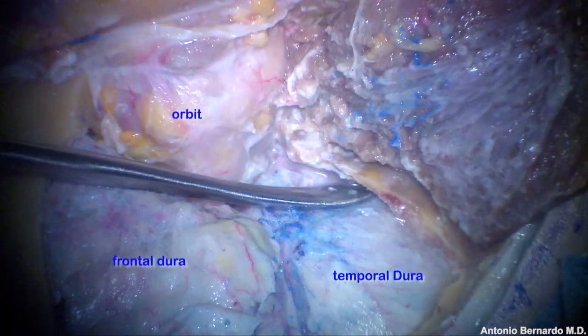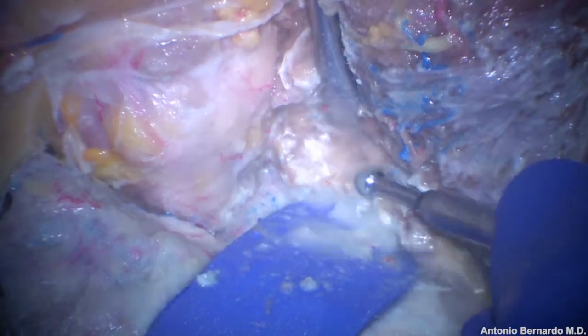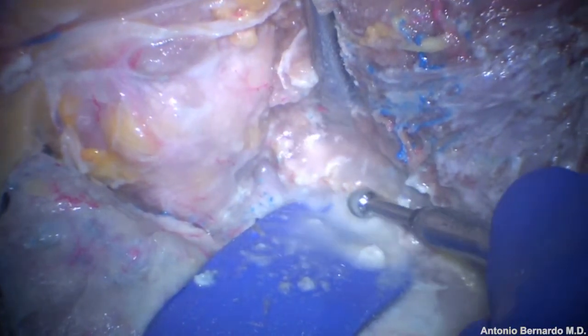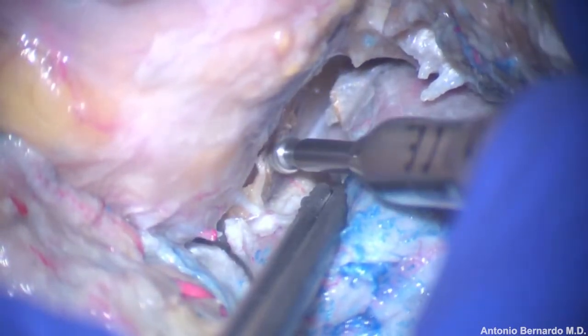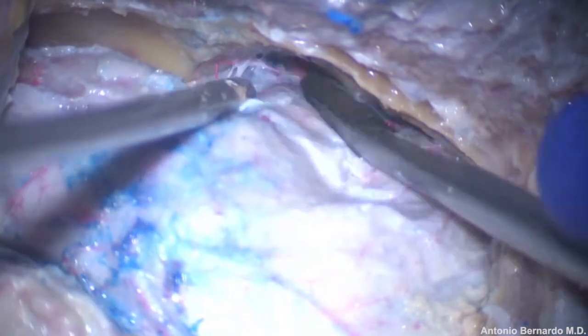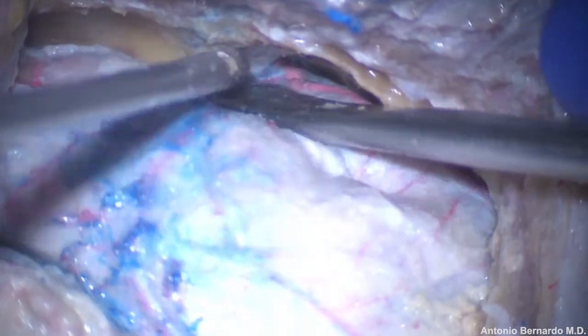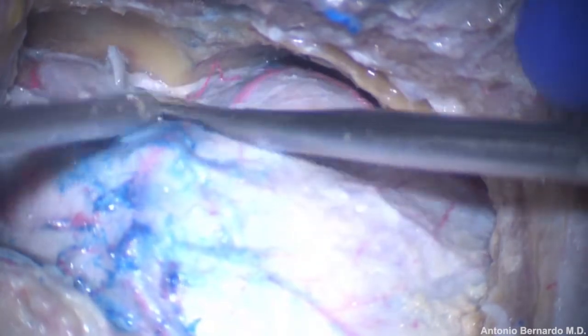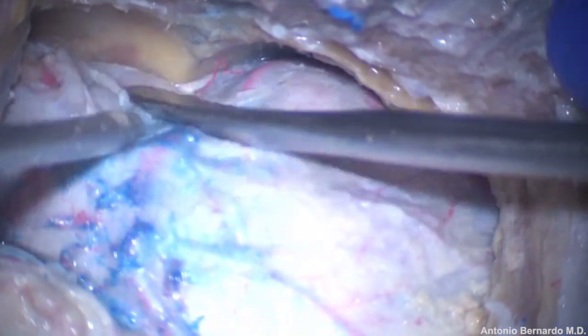Once the zygomatic arch has been removed, the removal of additional bone along the cranial base decreases the need for retraction. There should be no bone left between the orbit, the temporal lobe, and the frontal lobe. The dura of the temporal lobe is detached from the base of the skull, following the middle meningeal artery all the way down to the foramen spinosum.